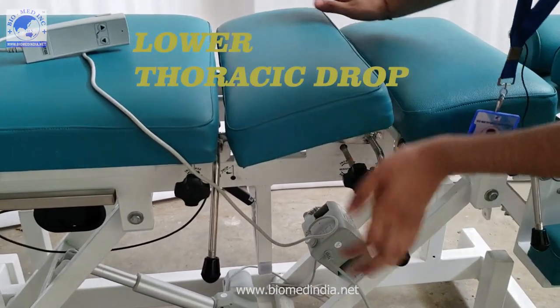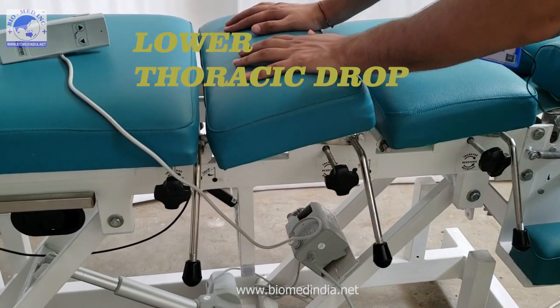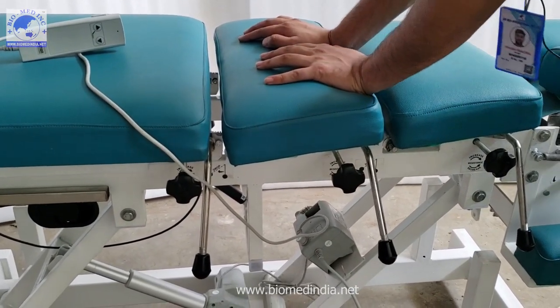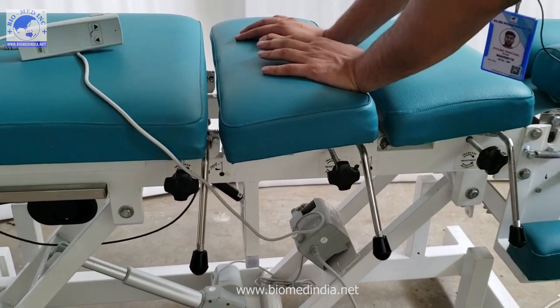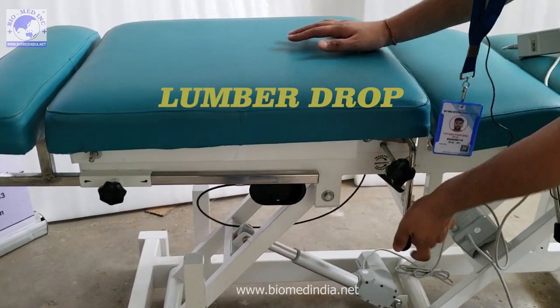This is the lower thoracic drop — very convenient to use. With our new technology, we have increased the smoothness of the drop and reduced the noise. This is the lower lumbar drop, which has two features.